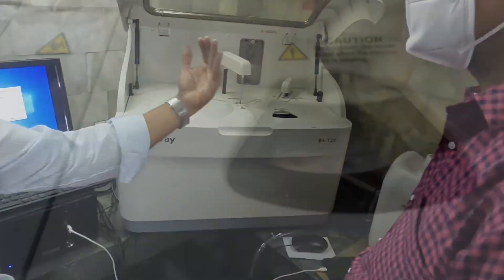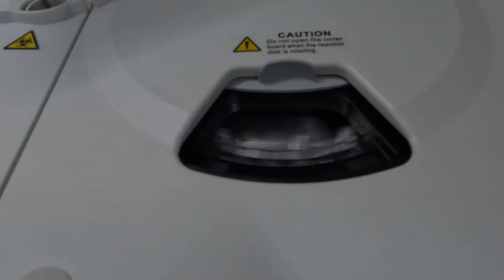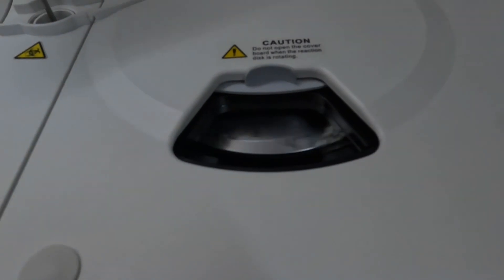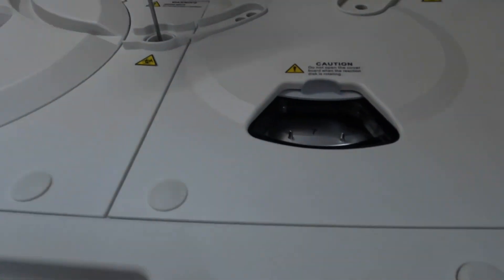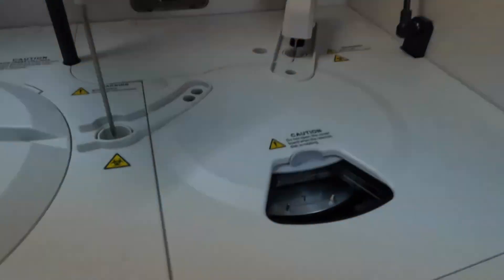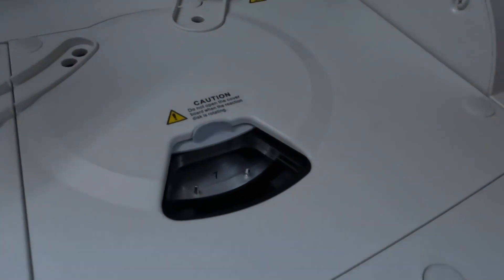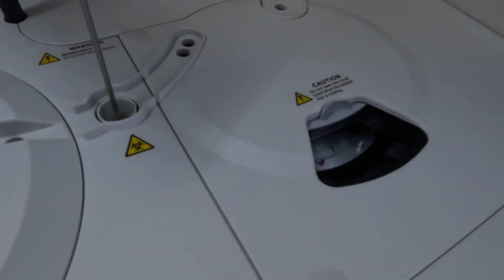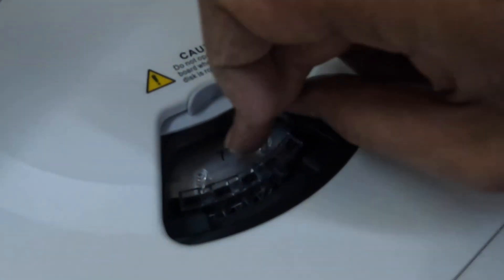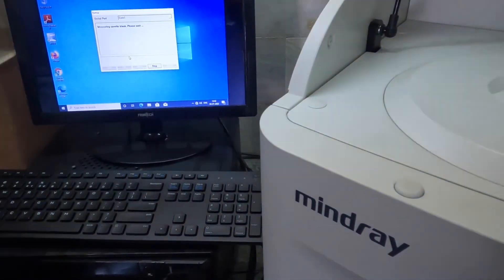This is the chief technician who is getting accustomed to this new automated machine which has come to his laboratory. This is how the cuvettes rotate inside the machine, and everything is explained by the machine team and our Blood Test team as well, so that the laboratory staff gets well oriented during our three-day training program after machine installation. This is the cuvette area, where we load the cuvettes, and we have asked the technician himself to get accustomed by loading the cuvettes.